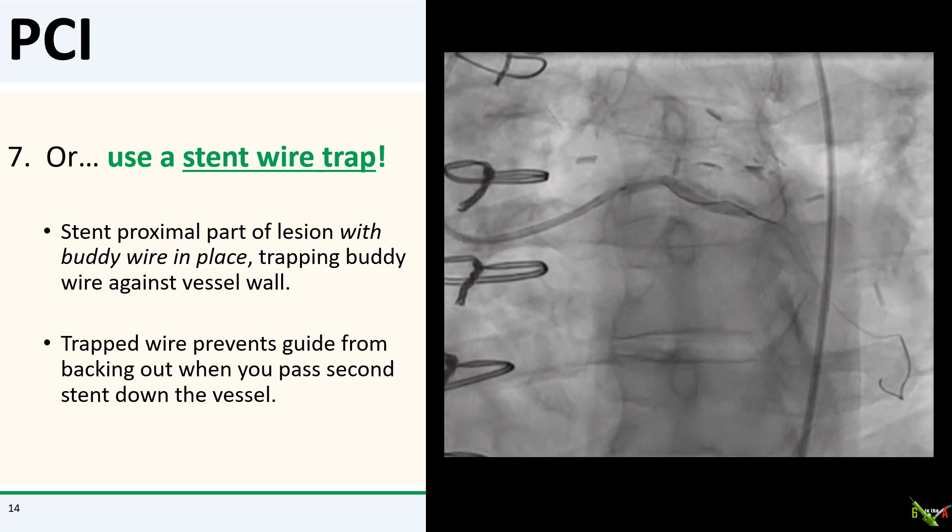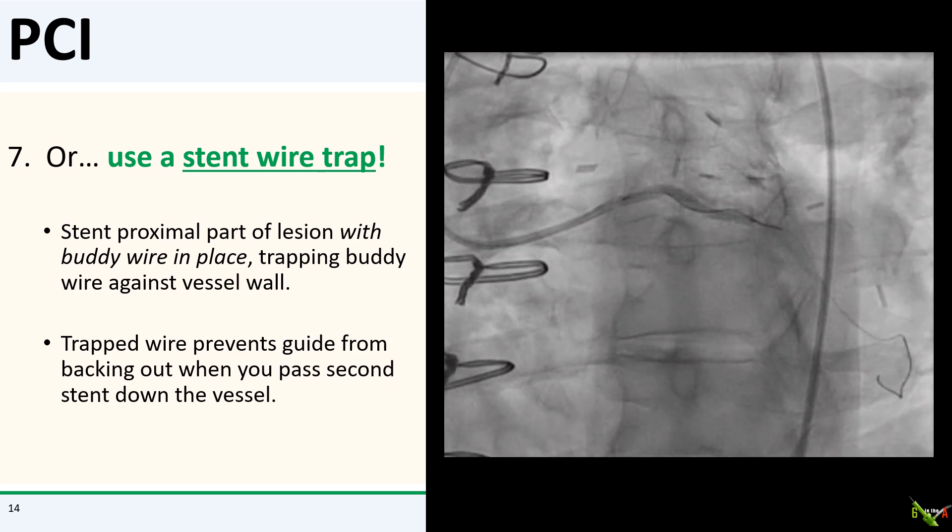If you already have a buddy wire in place and if your lesion is long, the idea is that you stent the proximal part of the lesion first and intentionally trap the buddy wire in place between the stent and the vessel wall. Once the buddy wire is trapped, it basically acts as an anchor that will prevent your guide from backing out when you're pushing your second stent down the vessel. As you can see here, we deployed our stent from the left main into the proximal circumflex and intentionally trapped our buddy wire in place.